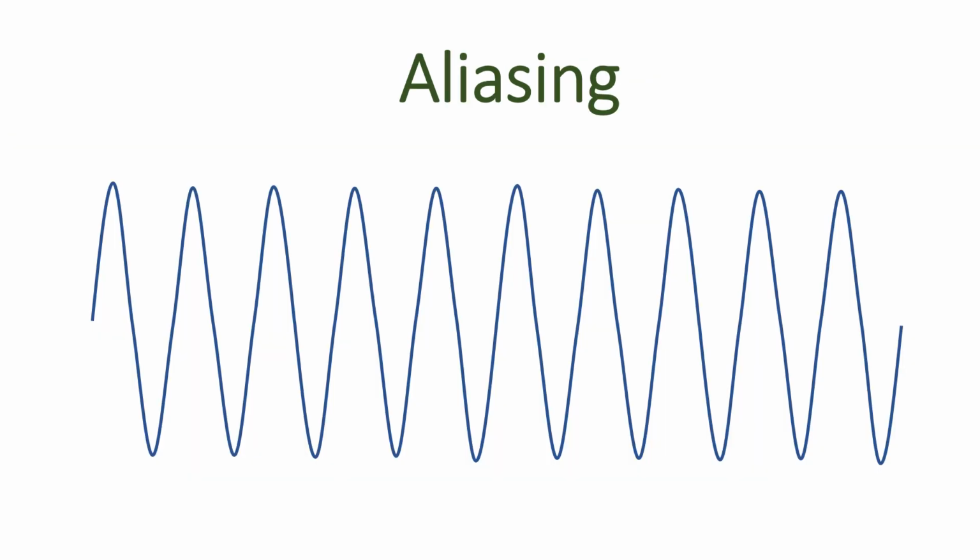In pulse Doppler mode, the ultrasound is emitted in short pulses at a certain frequency. So the measurements of the Doppler shifts are also performed not continuously, but at the pulse repetition frequency. Let's say this curve displays the echo signal from an artery. It is higher than the pulse repetition frequency of the ultrasound.